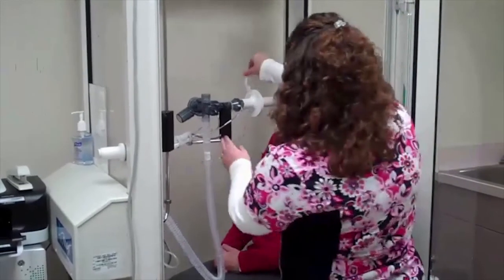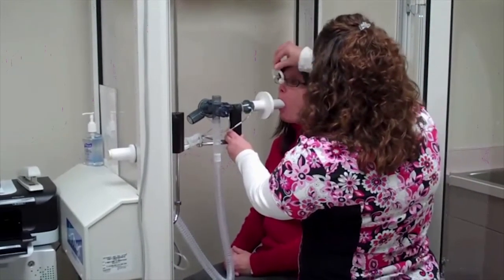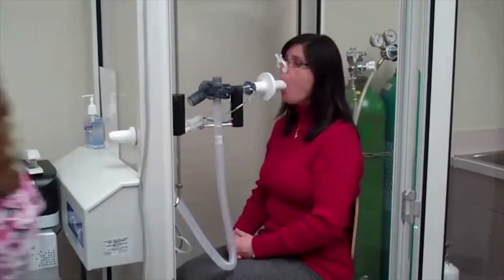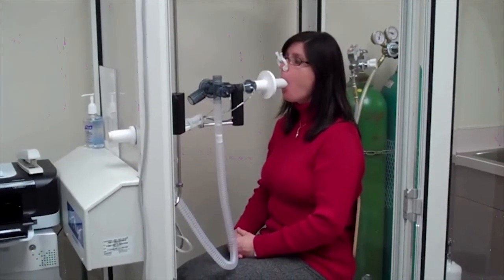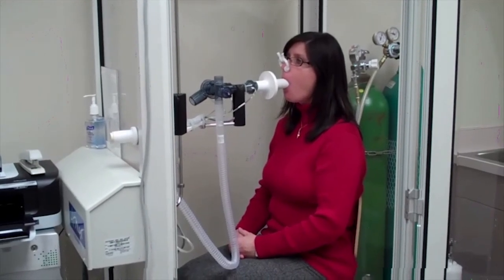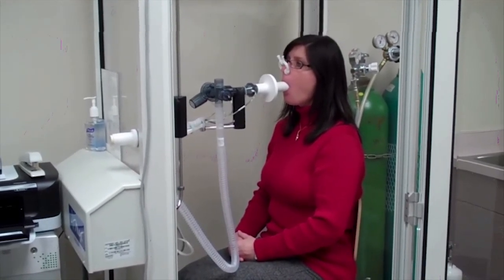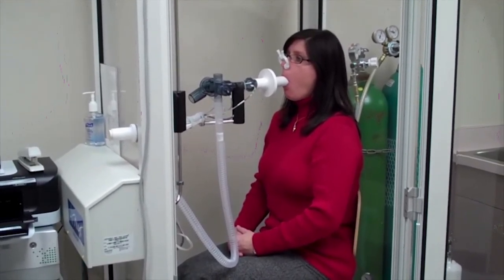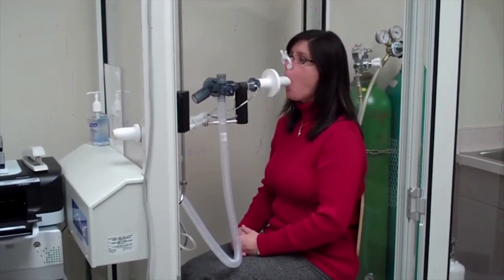Okay, mouth around for me. Nice tight seal. On your nose. Go ahead and breathe normal for me. Okay, big breath in. Now blow it out. Blow, blow, blow.